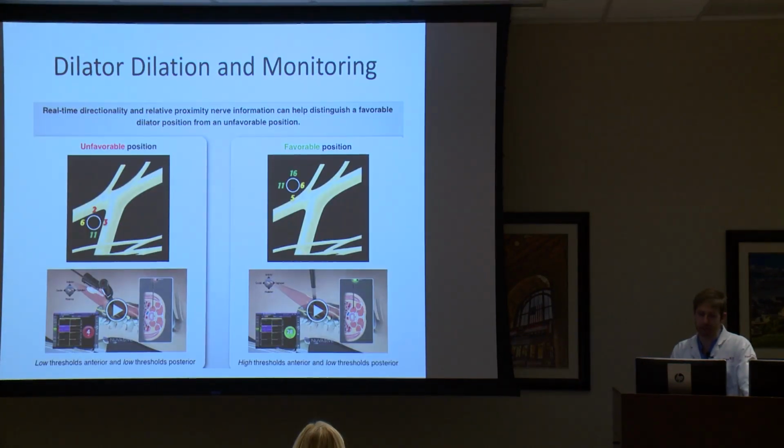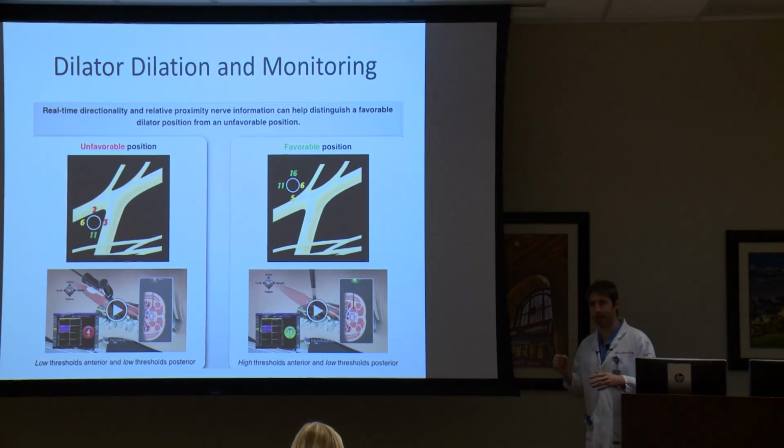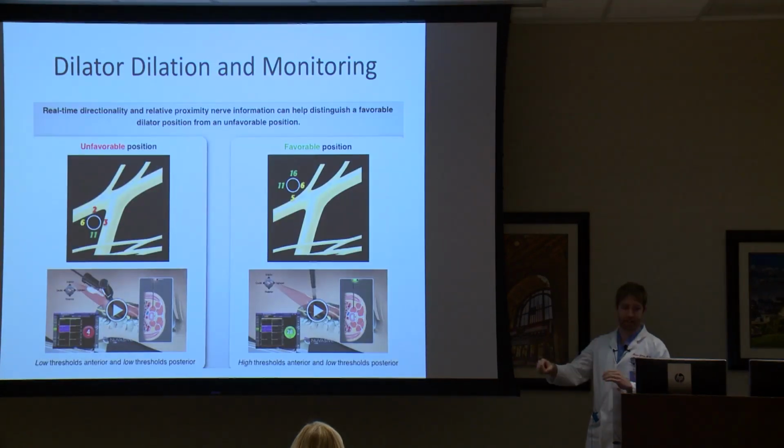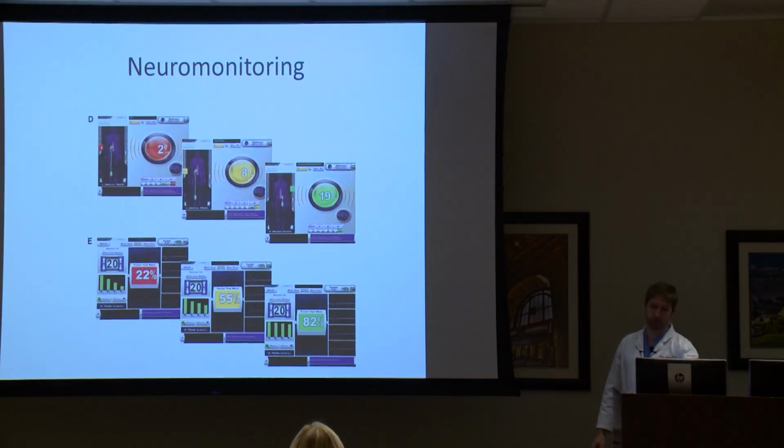That, and NuVasive's got this little funny thing like we showed earlier. It's cool because you don't have to call in the neuromonitoring folks. You essentially do the neuromonitoring yourself. When you do that probe that I talked about, you have this little station that they tell you to put down. There's the NeuroVision, that's that little thing right there. When you put it down, this is the screen that you see.